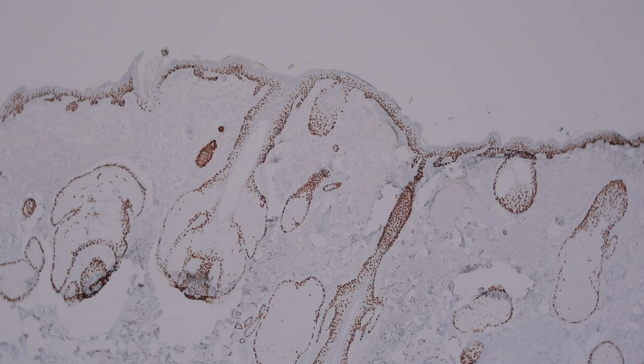Hi, I'm Jared Gardner, and this is part 2 of the normal skin histology immunohistochemistry video series, and I'm just going over some different immunostains in the skin and talking about the way they normally stain the normal skin structures.